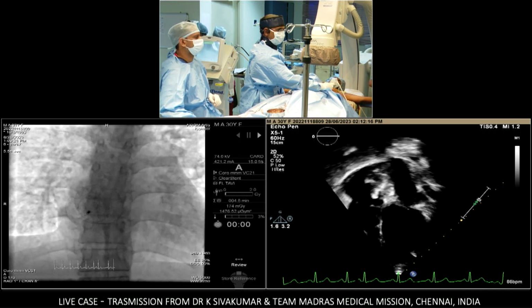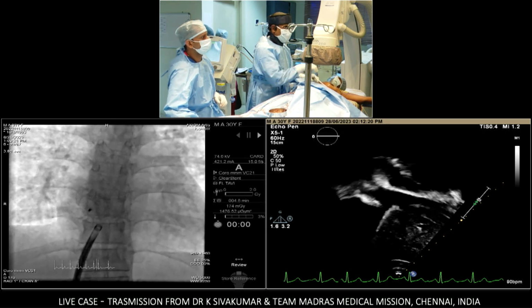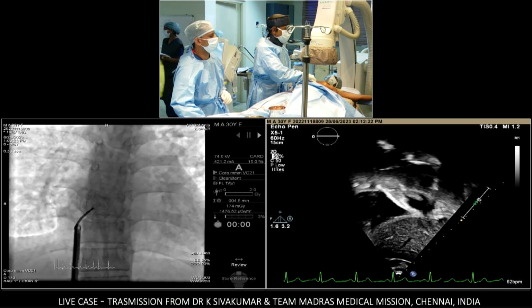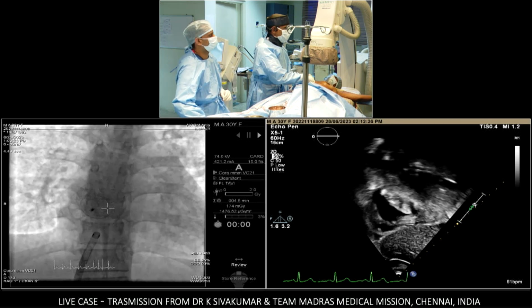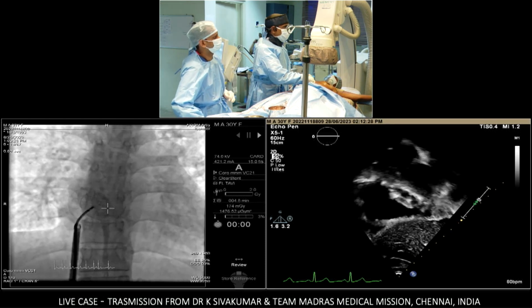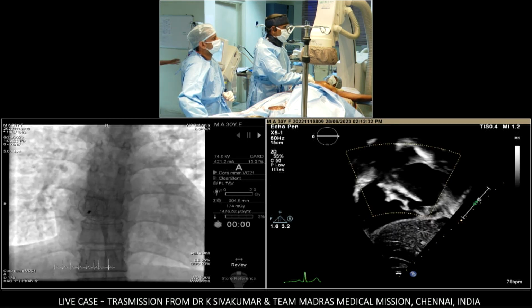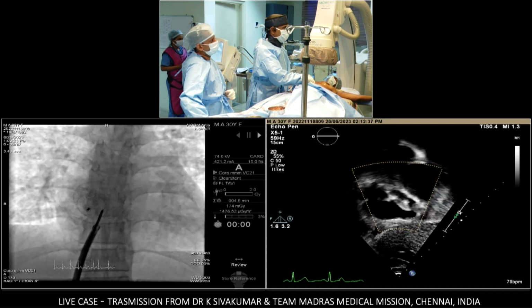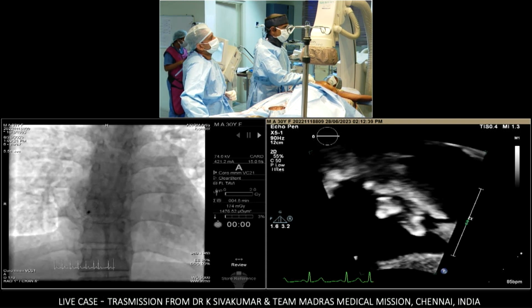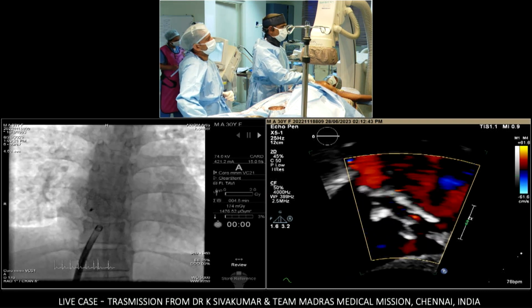On fluoroscopy, that LAO view that you showed before, can we see the LAO after release? Shiva, can we see the LAO after release? I will show you now. I'm just getting the subxiphoid short axis. We can magnify on this. Okay, color now. Then we need to move.